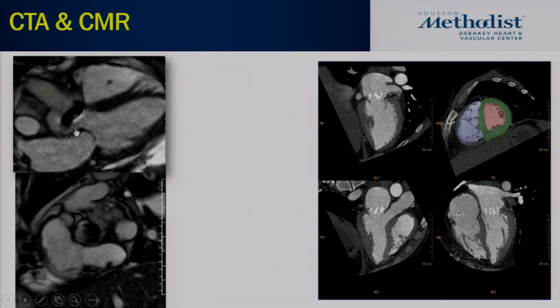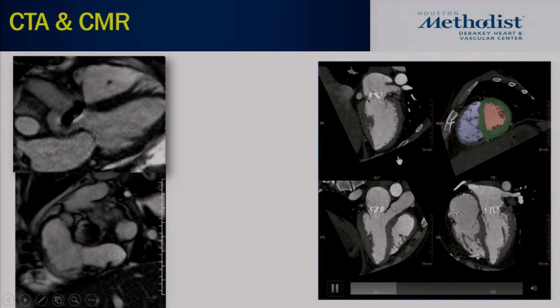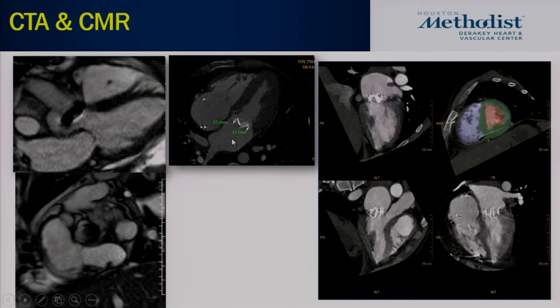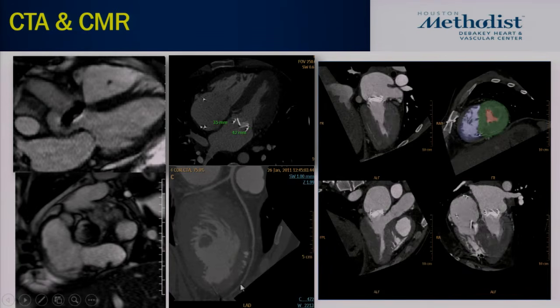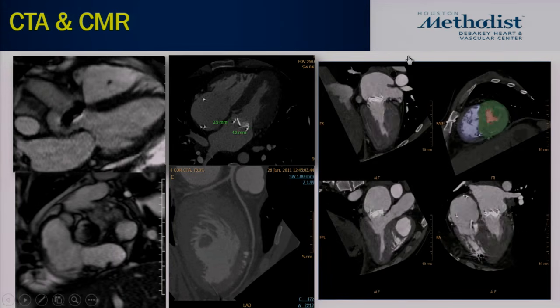This is another case of prosthetic endocarditis where you can see some valve dehiscence and an abscess collection. This is the same patient with CT, and this case is courtesy of Dr. Nabi, where you can see some dehiscence of the valve, the different complications of endocarditis, and clean coronaries for this patient who went for surgery, even on the older systems.